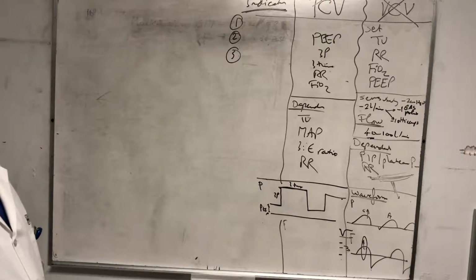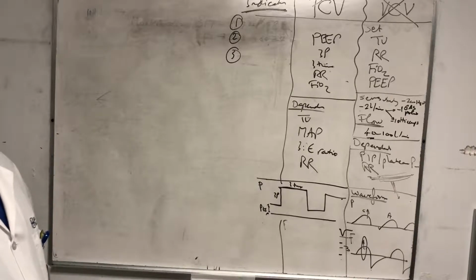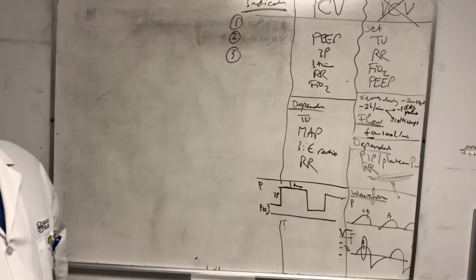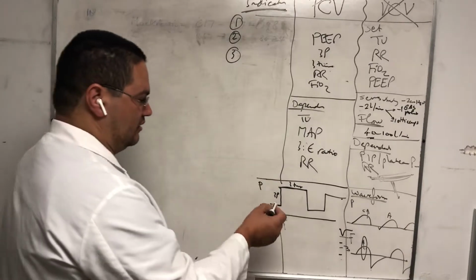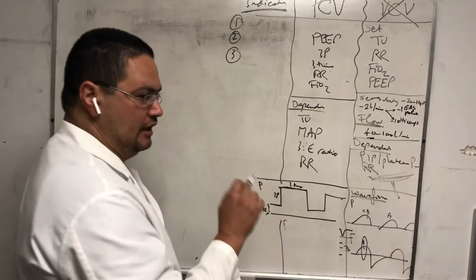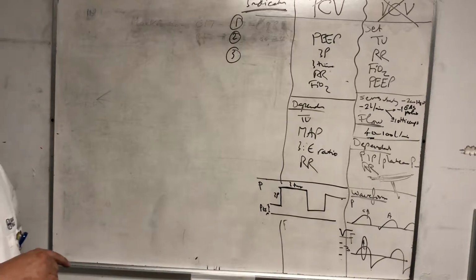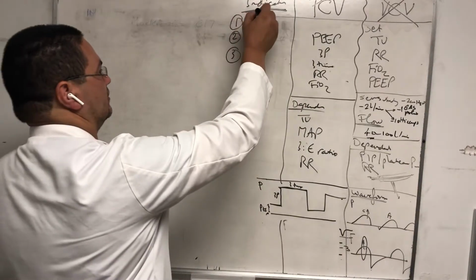So we talked about one 2 minutes ago, 5 minutes ago. Remember the air hungry patient when we reach 100 liters per minute flow? If he's still air hungry, we give him pressure control, because pressure control doesn't care what you need out of the flow. It will reach from this pressure to this pressure instantly, and give you whatever flow it takes to achieve that. So we'll give you unlimited flow. The patient rarely has air hunger in pressure control. So number 1, air hunger.